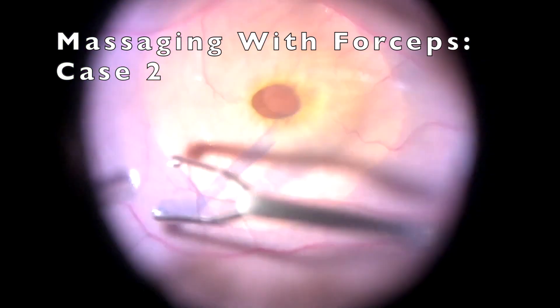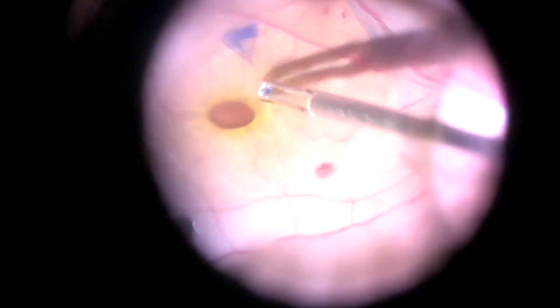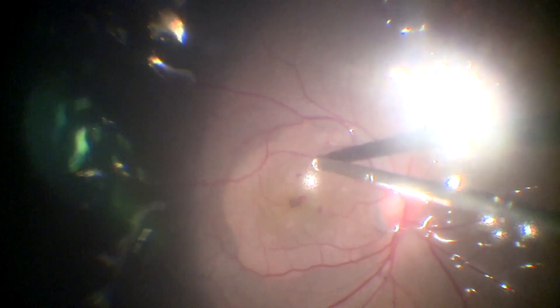Another case of a recurrent macular hole where we have used the same technique to relax the edges of the hole. This is followed by an air fluid exchange, after which the hole decreases in size.